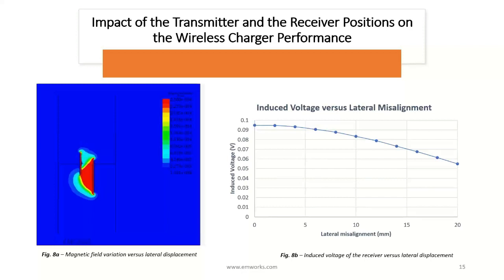As we have done for the axial air gap, we can see the magnetic field distribution versus different distances. It is clear that the magnetic flux is not able to fully reach the receiver when the axes move away. Hence, it's obvious that the induced voltage in the receiver is going to be smaller when the distance becomes larger.